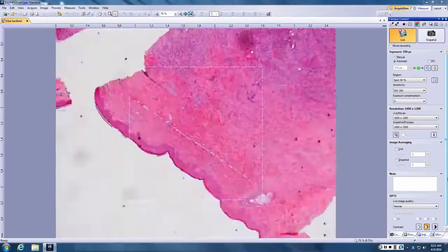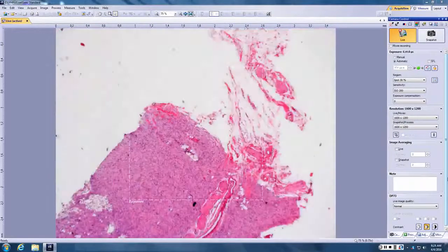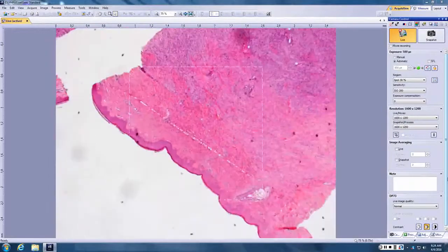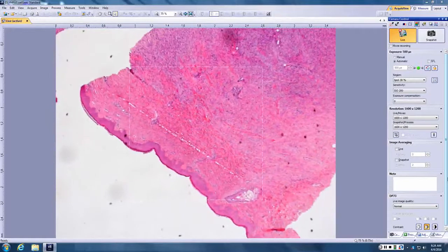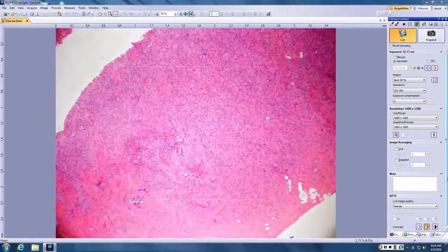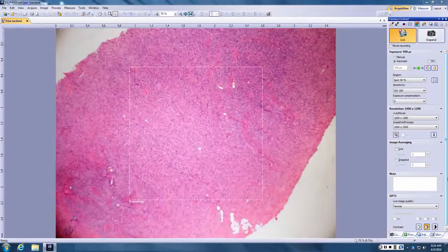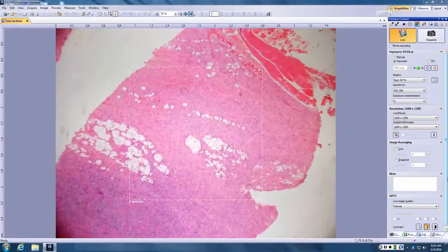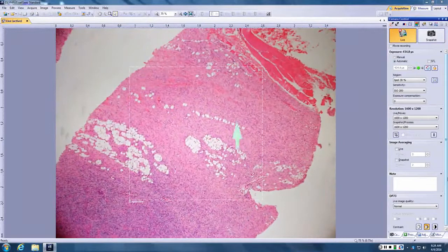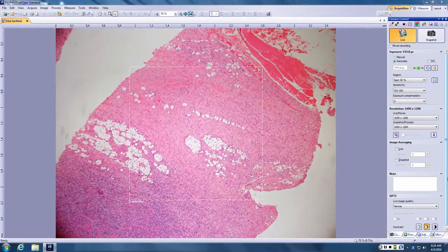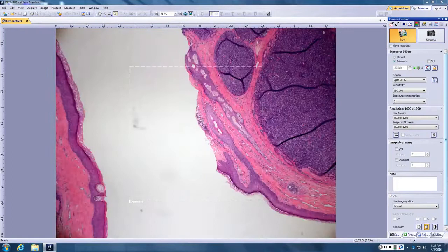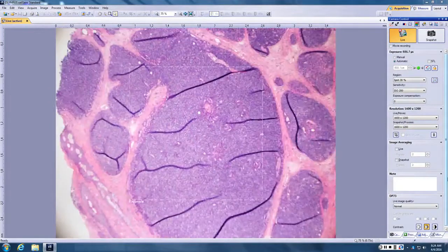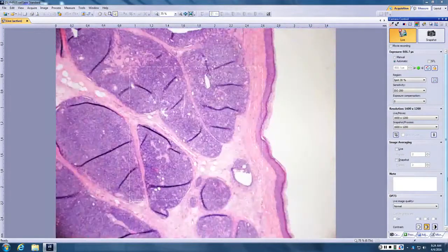You have something slamming against the epidermis. Does it really slam against the epidermis or is there more of a spared zone and then the hypercellular tumor? Exactly. So it looks like a DFSP. So DFSP would be for a hypercellular spindle tumor that has single file lipocytes. DFSP would be a very good guess. Excellent.